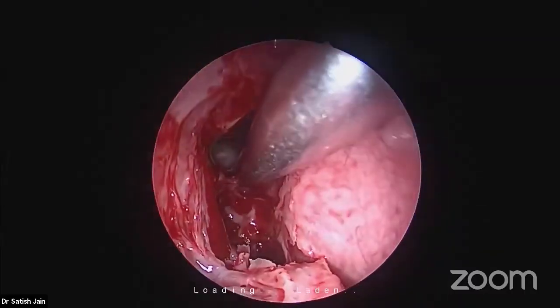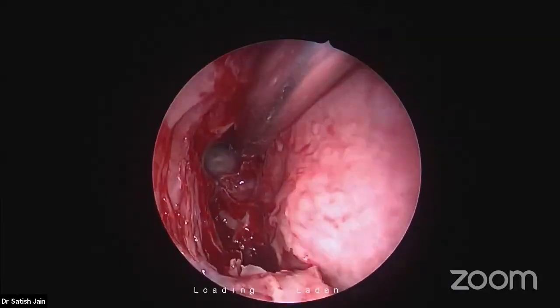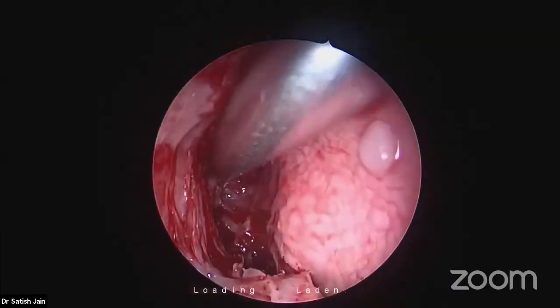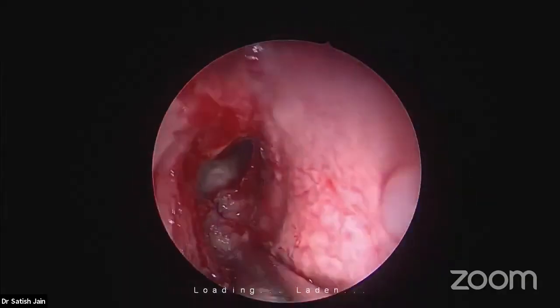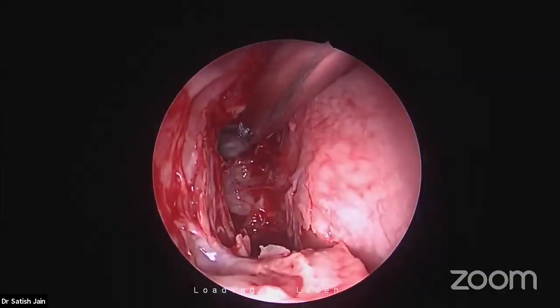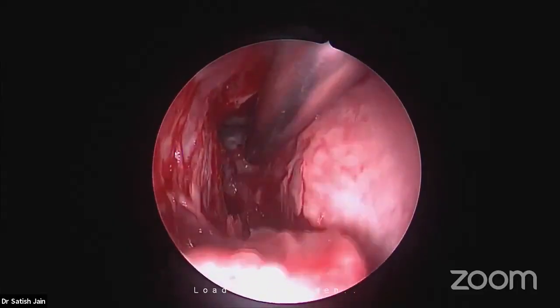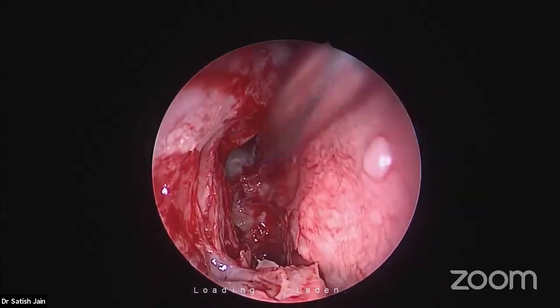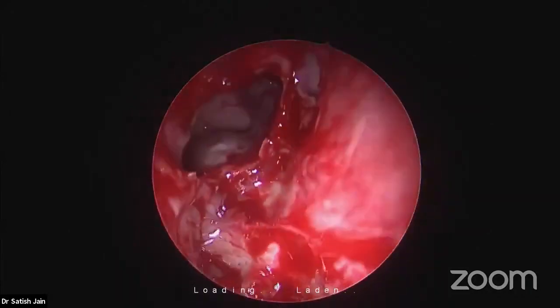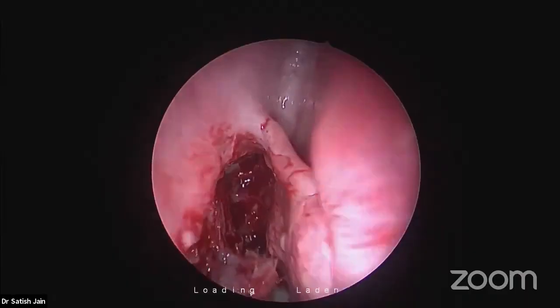And see, this has other names also. See the suprabullar recess? Can you see it very clearly? This is also known as fovea. Fovea literally means impression. This is the ethmoidal cell, and this roof where I am touching, this cell's roof is formed by the frontal bone. So it creates an impression on the frontal bone above. That's why it is known as fovea ethmoidalis as well.